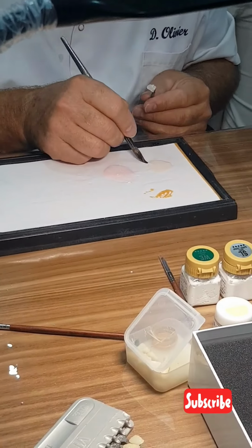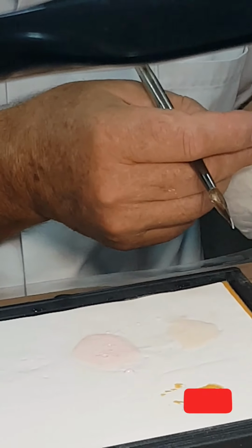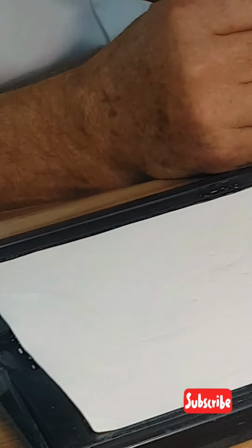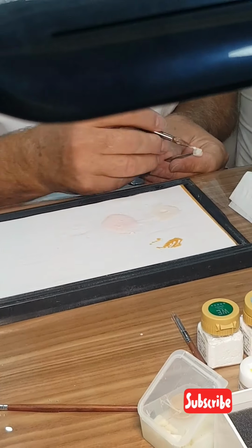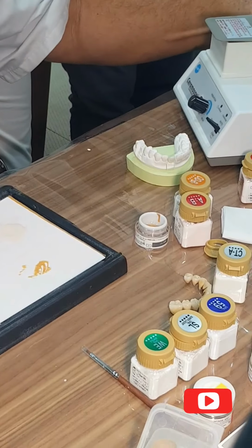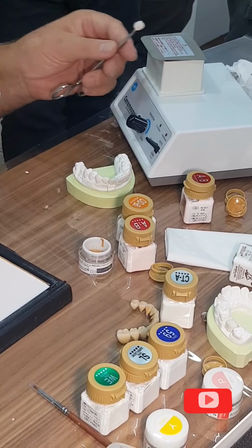My root, all around. Look, I do that, all around, and I condense. I will explain something for the bridge specifically later, in the afternoon. And I condense. What does it mean? That I'm going just to condense.